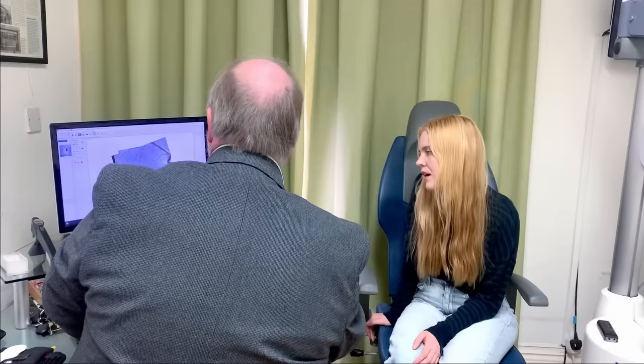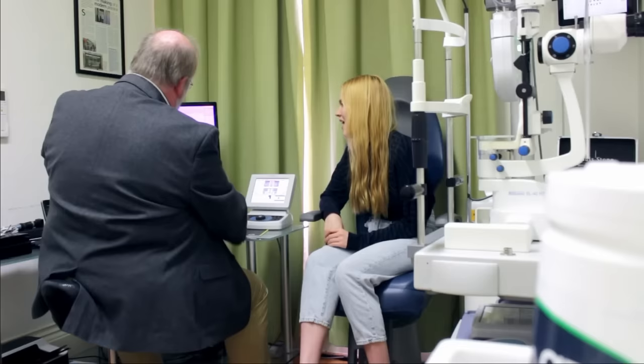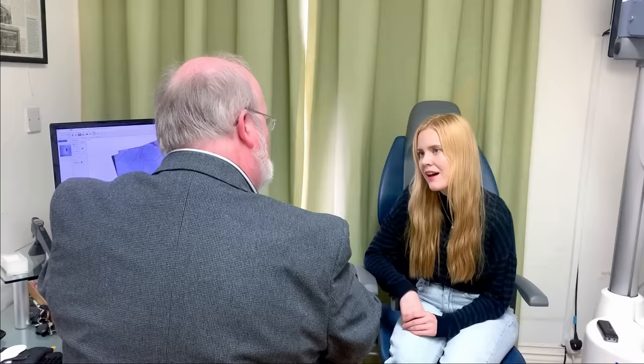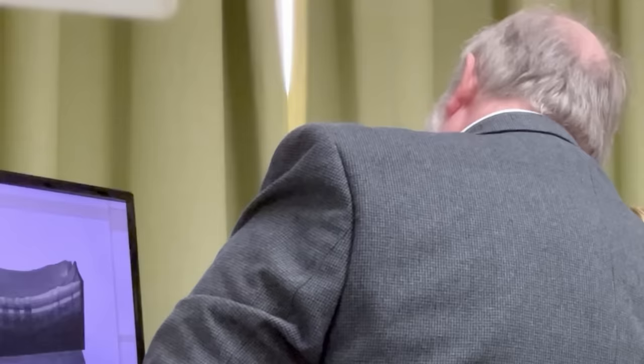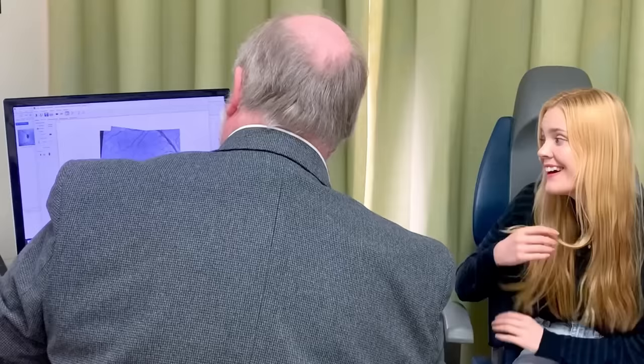I don't know if you noticed when I was shining the light in, you saw some like tree branches. I did, yeah. And this is your blood vessels. Because they sit on top of your retina, and the photoreceptors are underneath, when we shine a bright light in, you get a nice little shadow of your own blood vessels. And I saw my own blood vessels. Indeed. You can see these sort of lines here. This is the shadow. All these little shadows, because the light doesn't get through your blood vessels very well, because, strange enough, they're full of blood. So that's your fovea, and that looks lovely and healthy as well.